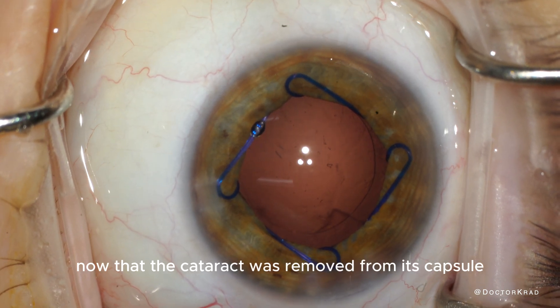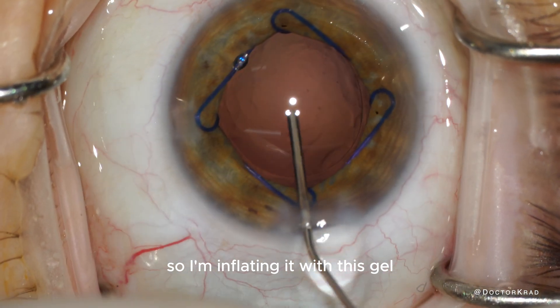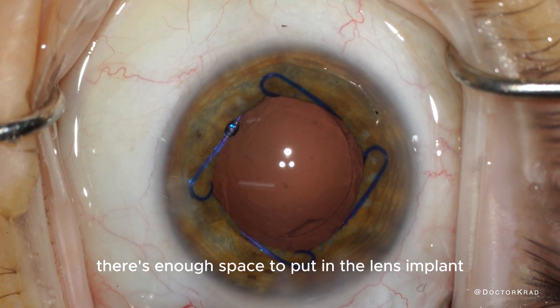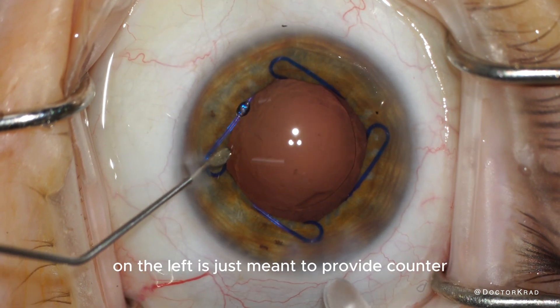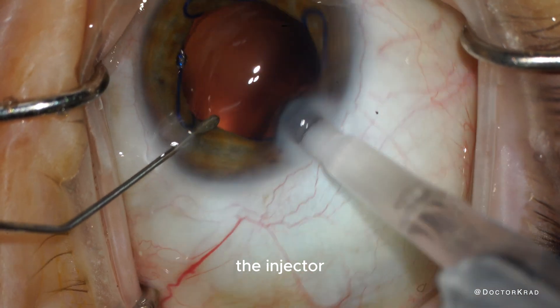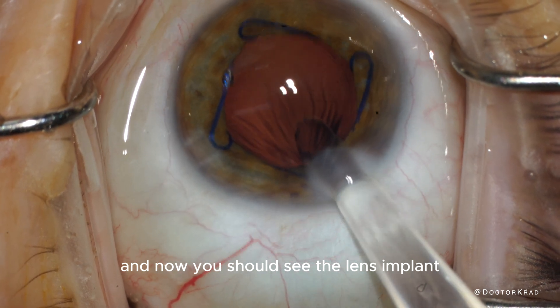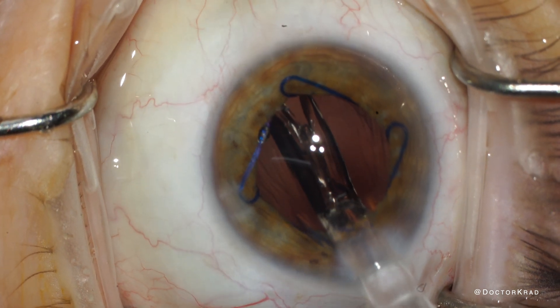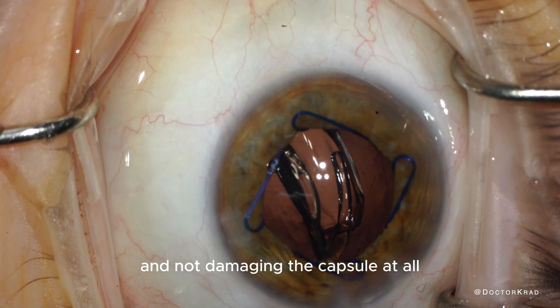Now that the cataract has been removed from its capsule, the capsule is deflated, so I'm inflating it with viscoelastic gel. Now the capsule has expanded and there's enough space to put in the lens implant. The instrument on the left provides counter traction and stabilizes the eye. I insert the injector into the main incision and you should see the lens implant travel through the barrel of the injector and into the eye. I inject it very slowly towards the end to make sure I'm not damaging the capsule at all.